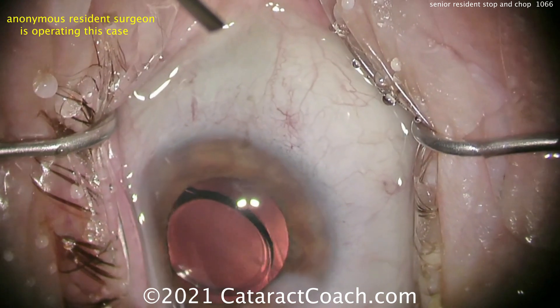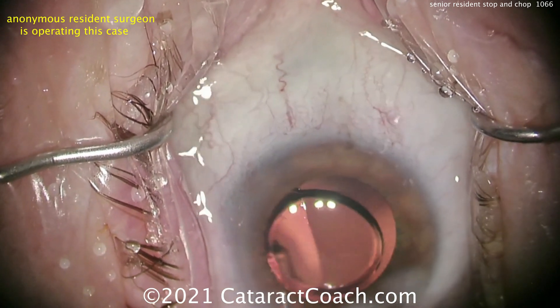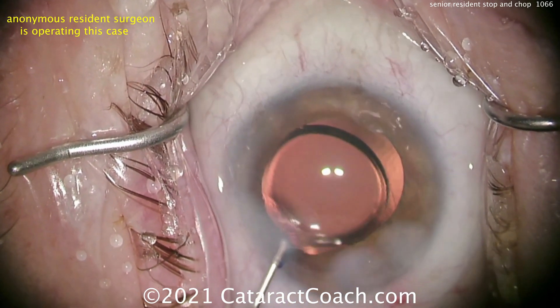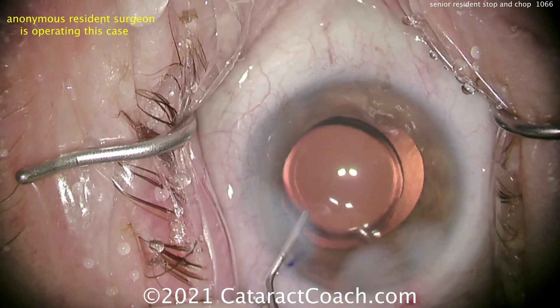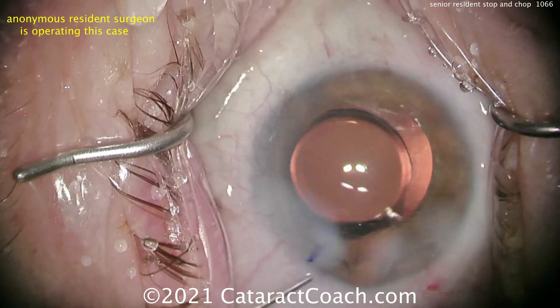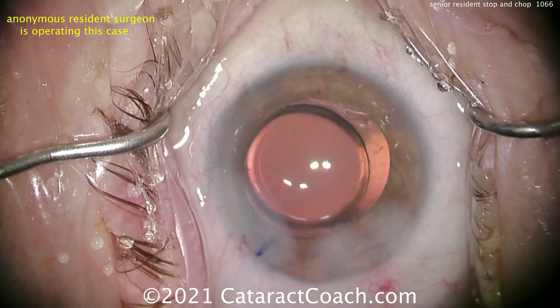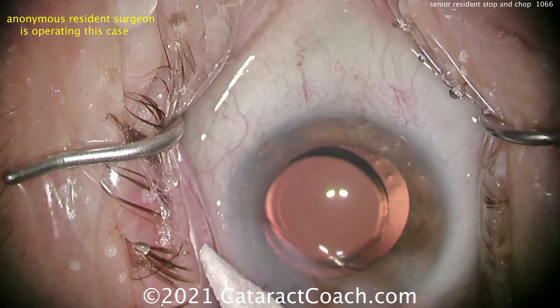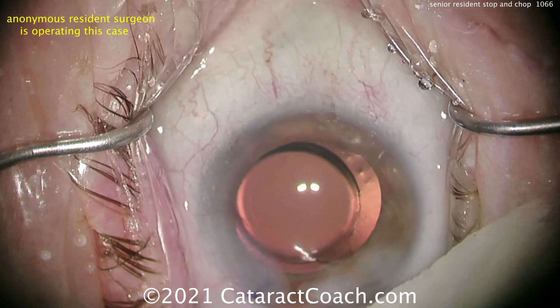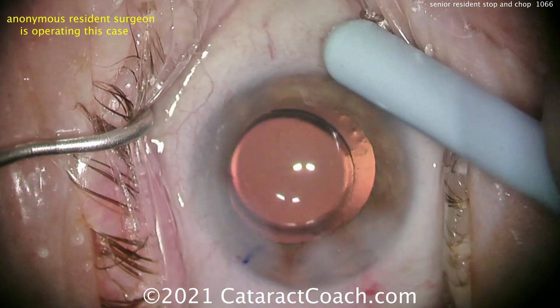At the end here, don't do the hydration like that. You want to barely hydrate the roof of the incision — not those two big white balls. Now hydrating the paracentesis — too much hydration, not enough precision there. And center up the optic at the very end of your case — that's probably the most critical thing. But overall, you've got fantastic hands. Be your own toughest critic. Watch this video and say: that's a good video, but I can do much better. Work hard every day to be just a little bit better, and you will be outstanding.